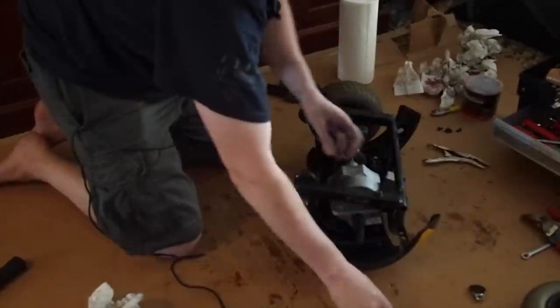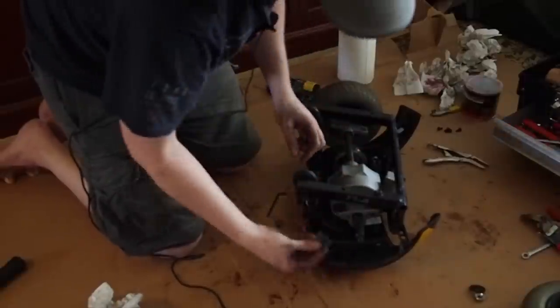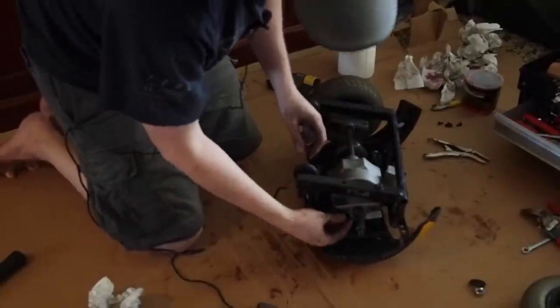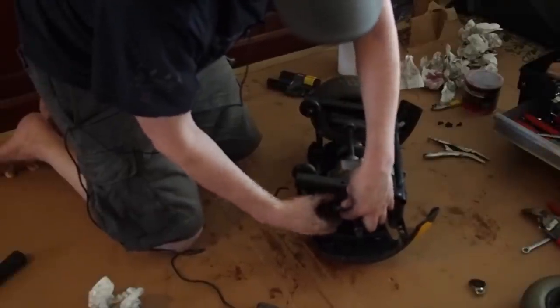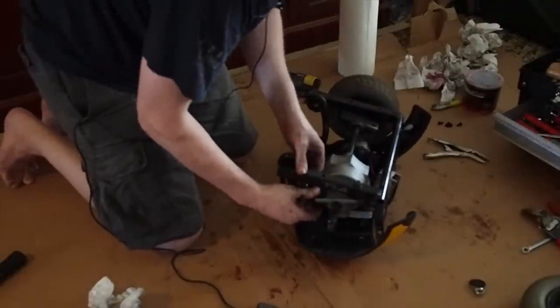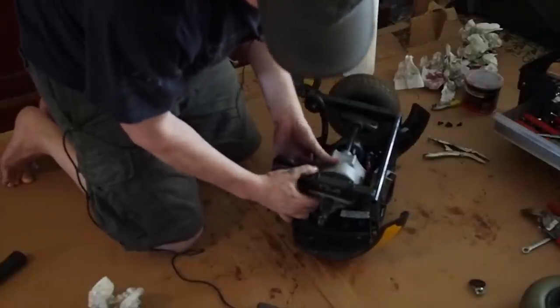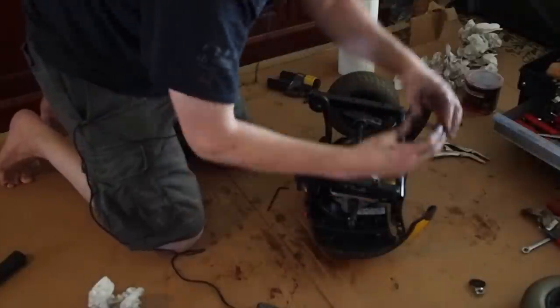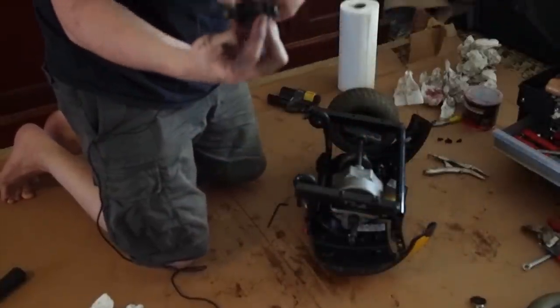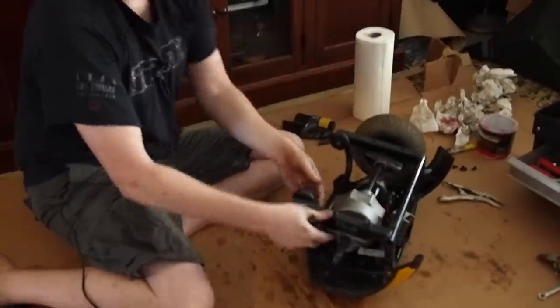These rubber washers that go on here are meant to simply keep vibration down. That's what they're for. And every engine I've ever worked on has some kind of washer like that. There's one on either side, and they go together onto the piece of metal so that these things fit into the holes. But that's to keep vibration down.